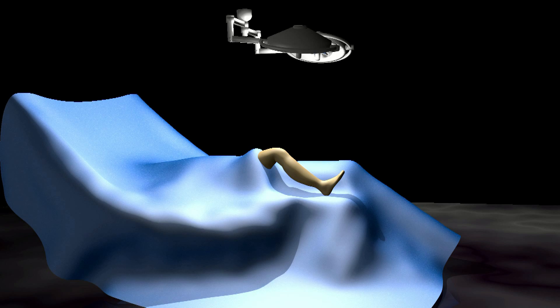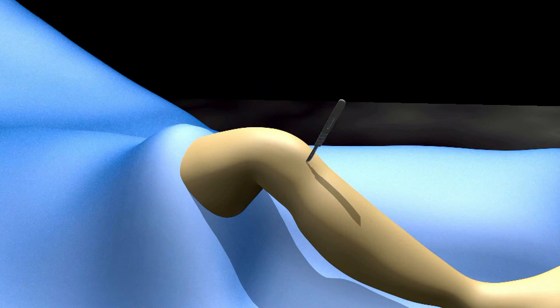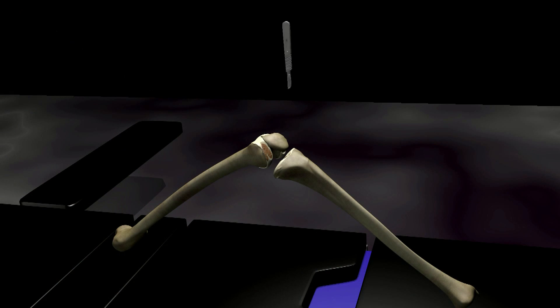An incision is made lengthwise down the front of the knee. With the skin and underlying tissue pulled out of the way, the joint capsule is exposed. Another incision is made and the patella, or kneecap, is pulled out of the way to expose the knee joint.